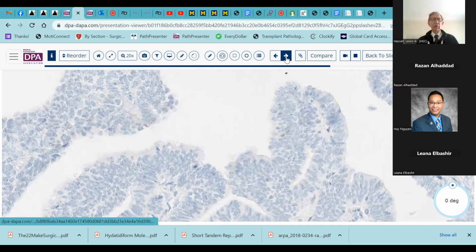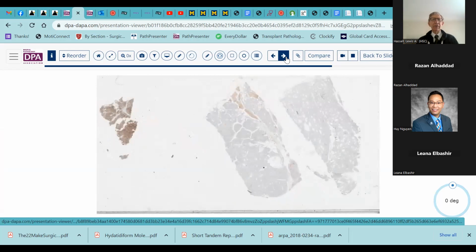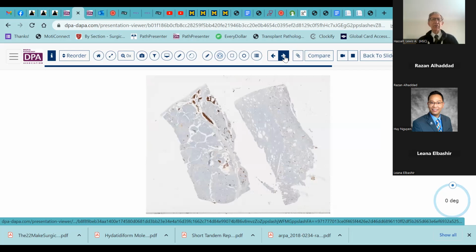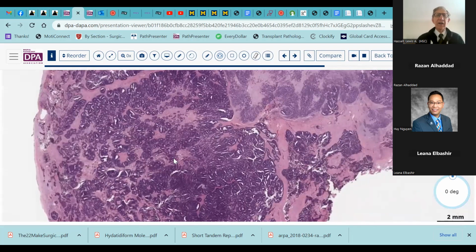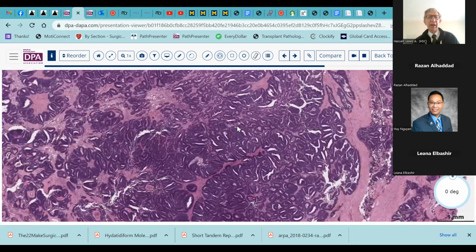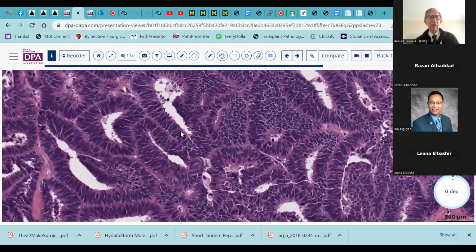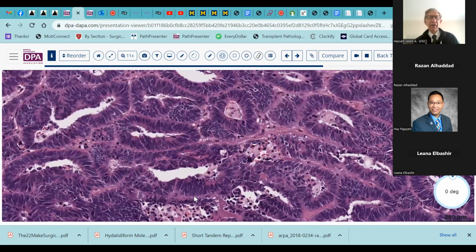So with that, let's quickly compare it to, let's go on here to the next case. You can come back to these and look at these stains in this regard. So this is another case or tumor in this area. And I've talked about this tumor elsewhere, but this is the contrasting case of a mesonephric-like carcinoma. And again, you can see it has this sort of intermediate-sized glandular tissue. You'd think about endometrioid-type tumors, fairly high-grade nuclei, and so forth.